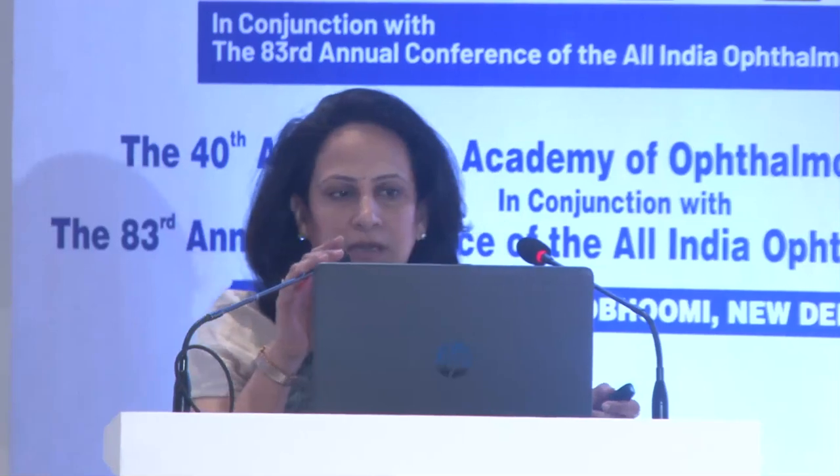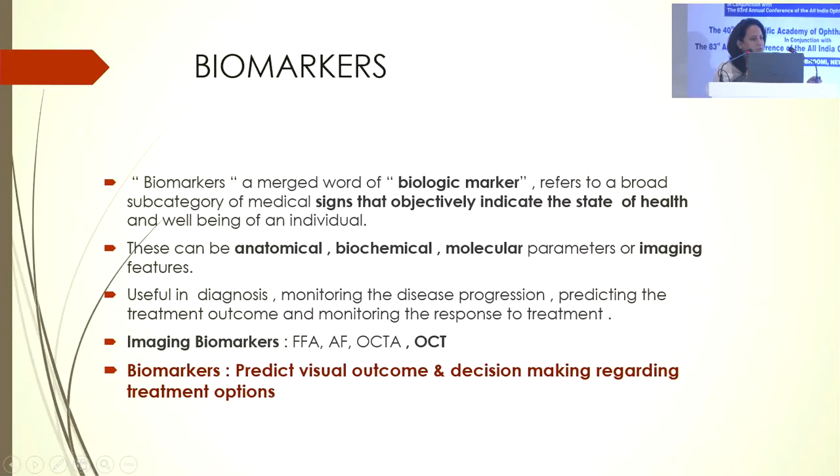At the outset, I'd like to thank AIOS and Guliani sir for giving me this opportunity. I'll be talking about OCT biomarkers in retinal vascular diseases, and I'll be restricting to diabetic macular edema because of the paucity of time. Biomarkers, we know, is a merged term for biological markers, which indicate the health of an individual or a disease.